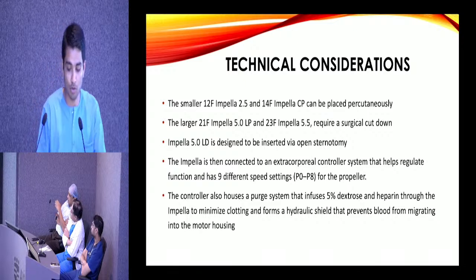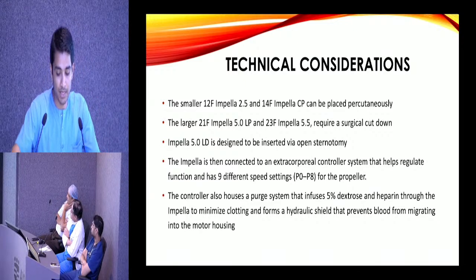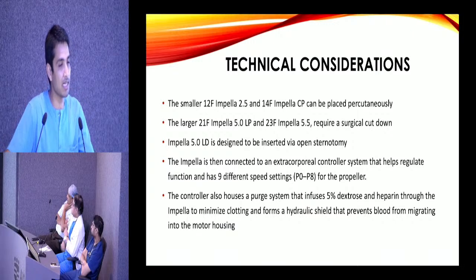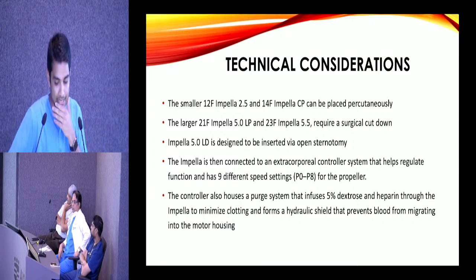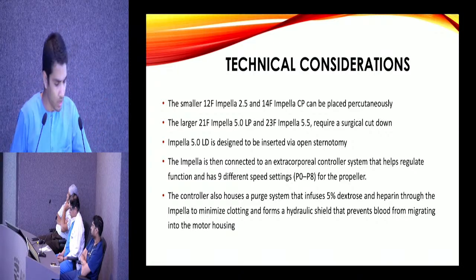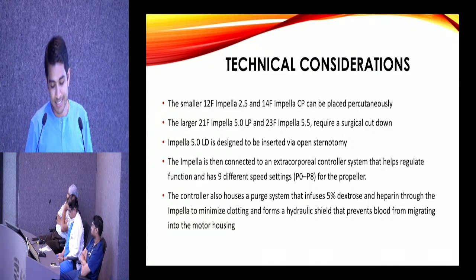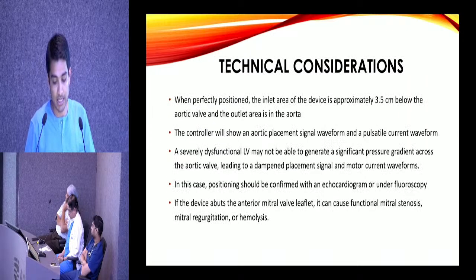So there is a controller, and we may have the module for everyone to look at that is external, by the bedside. The power goes from P0 to P8, and if you're doing PCI, you have a high burst setting where it's at max speed for a short period of time. Further technical details, I think, one can learn individually for each case.